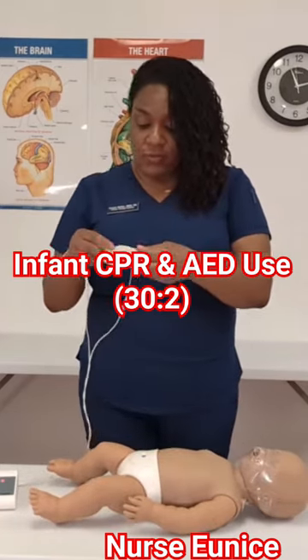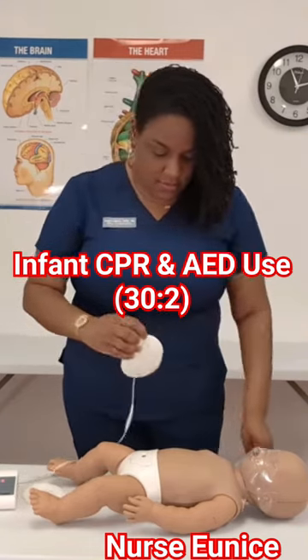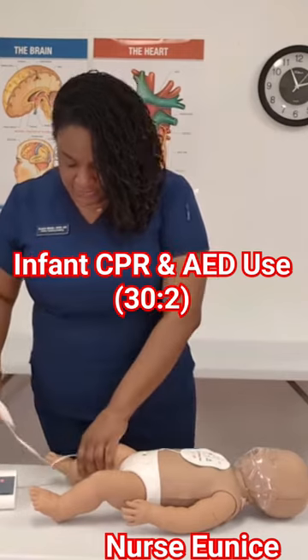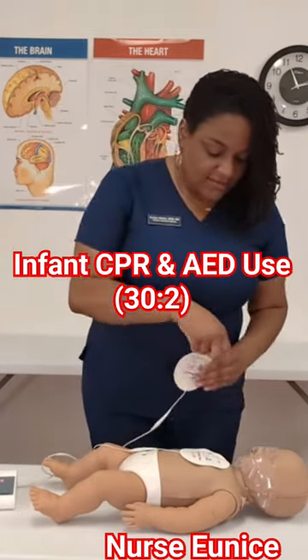So we are going to place one pad — apply pads, plug in connector — to the center front of the baby's chest, and the second pad on the baby's back.